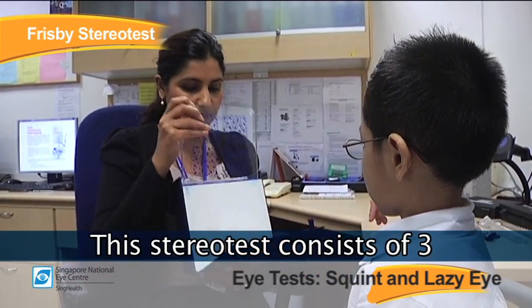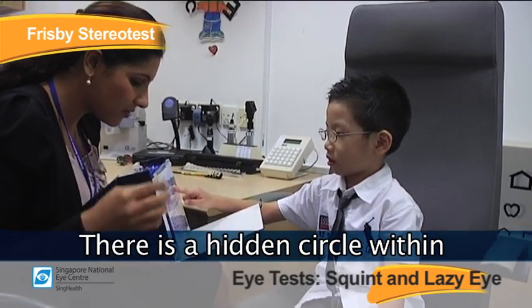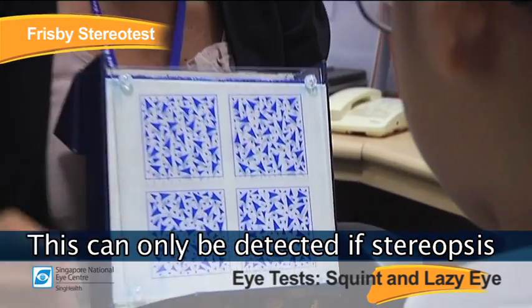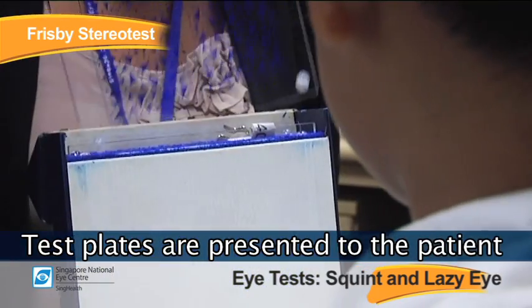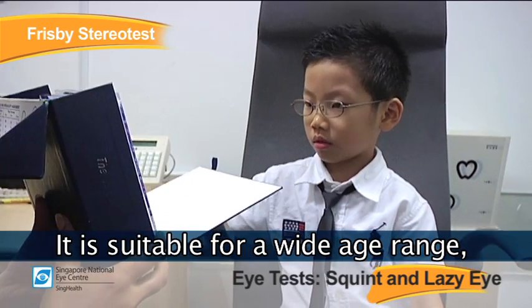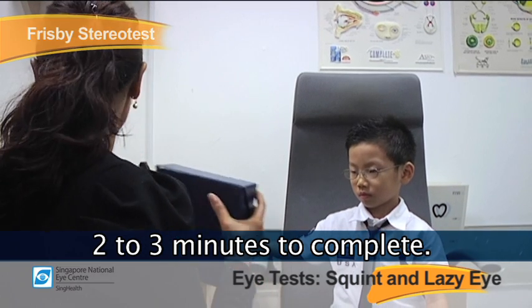Another stereo test consists of three test plates of different thicknesses. There is a hidden circle within one of the four squares on each plate, which can only be detected if stereopsis is present. Test plates are presented to the patient at a distance of about 40 cm. It is suitable for a wide age range, even young preschoolers, and the test takes about 2 to 3 minutes to complete.